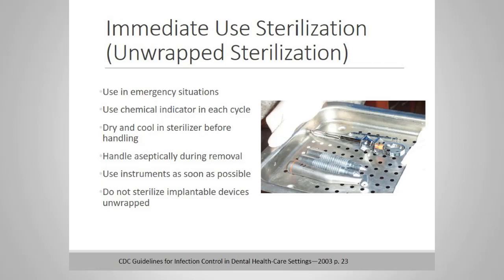A little bit about immediate use sterilization. Instruments may be sterilized unwrapped, but only in emergency situations, not routinely. Instruments that are used for implantable devices should not be sterilized unwrapped, and consider sterilization a process, not an event.